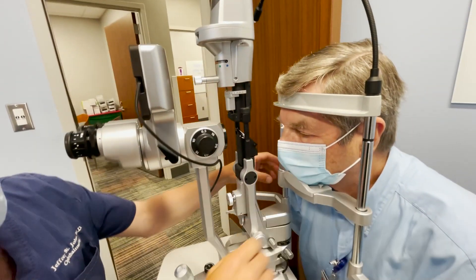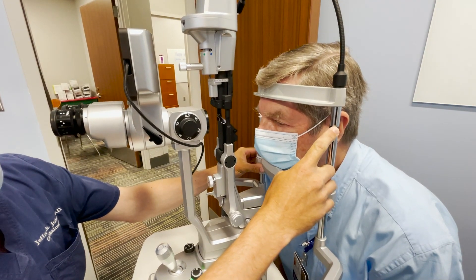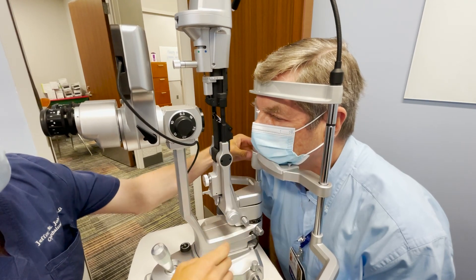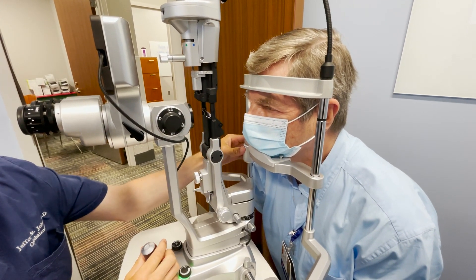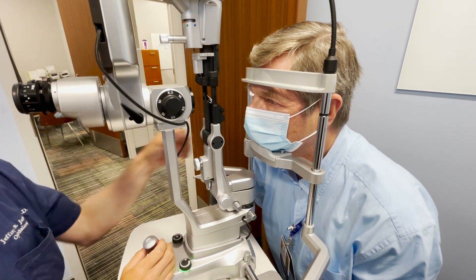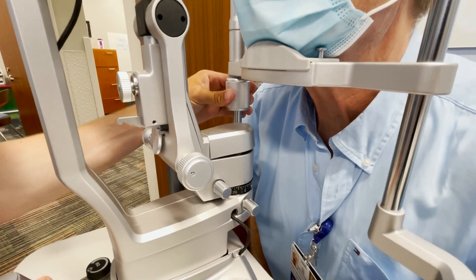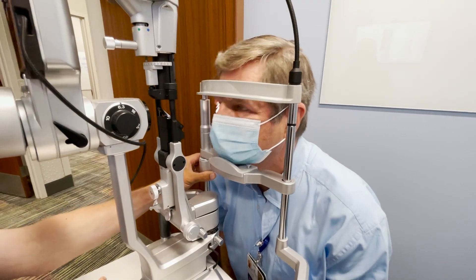The chin has to be here and the forehead needs to be all the way flush against the band. You can adjust the height — you want this black line to be parallel with the lateral orbital wall or canthus of the eye. That gives you the greatest range of motion with your slit lamp. Adjust that with this knob so it goes up or down, with the eye parallel to this black band.